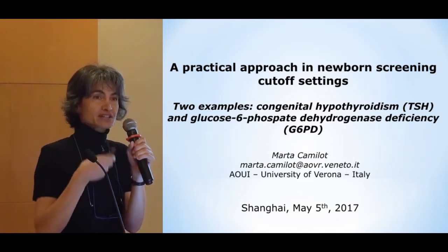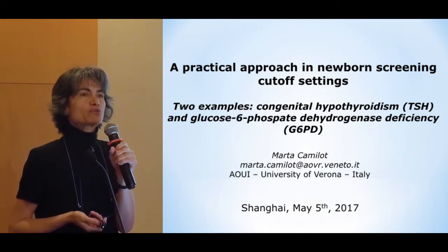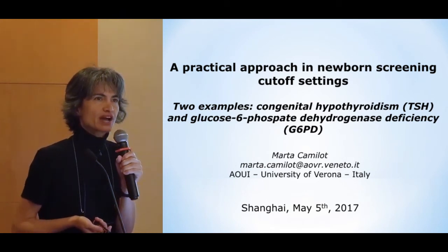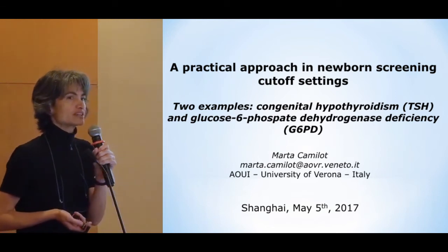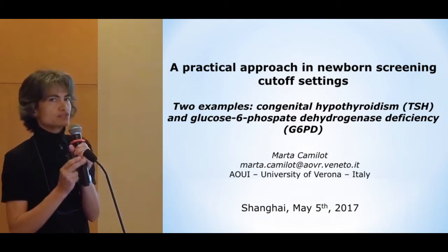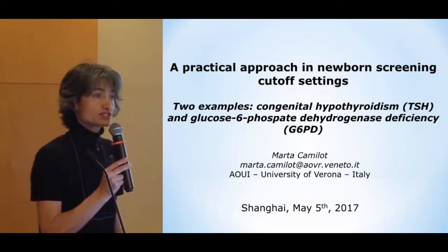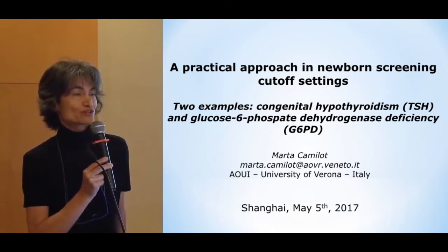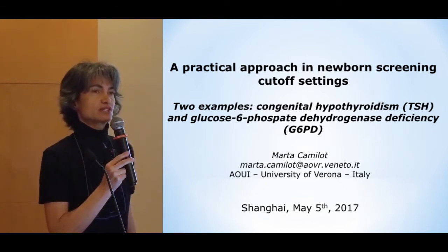I come from a city in the northeast of Italy where we run newborn screening for congenital hypothyroidism, congenital adrenal hyperplasia, galactosemia, glucose-6-phosphate dehydrogenase deficiency, biotinidase deficiency, cystic fibrosis, and tandem mass spectrometry with the extended newborn screening.